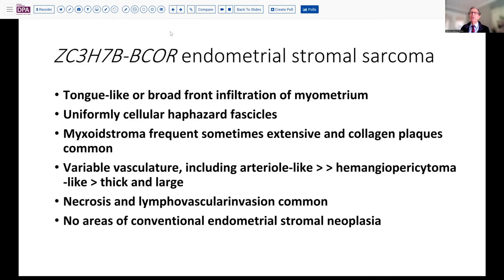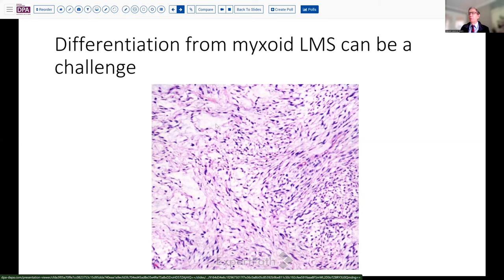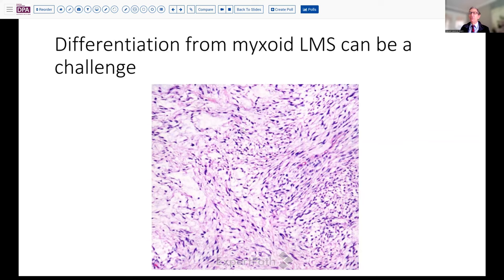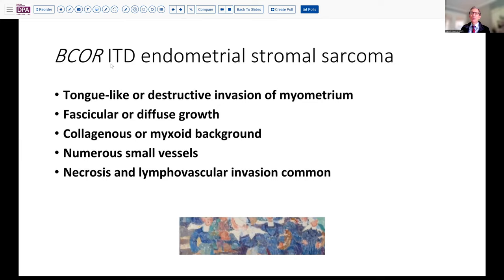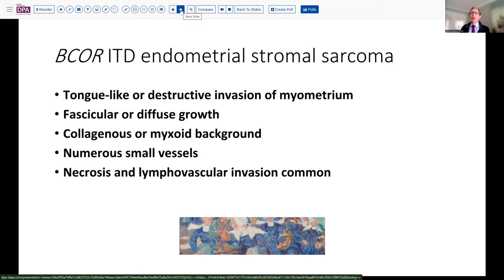If we look at the ZC3H7B-BCOR fusion process, that looks quite a lot like this situation with myxoid tissue and can sometimes even raise the possibility of myxoid leiomyosarcoma. In contrast, the BCOR internal tandem duplication also has a collagenous and myxoid background with numerous vessels, lymphovascular invasion, and destructive invasion. So this can look quite similar as well, and really is only going to be differentiated based on molecular genetics studies.